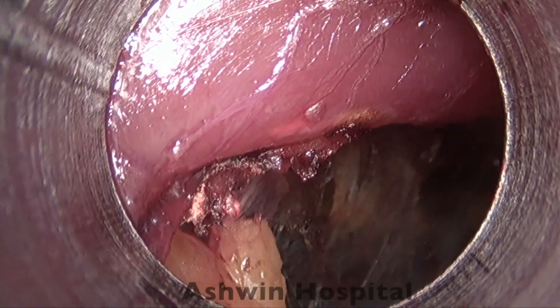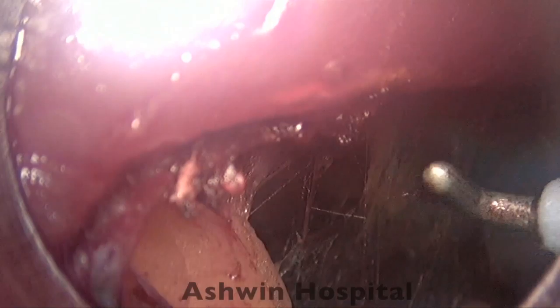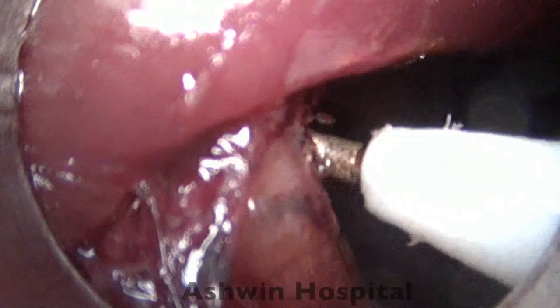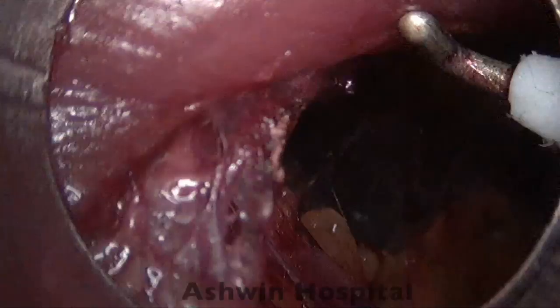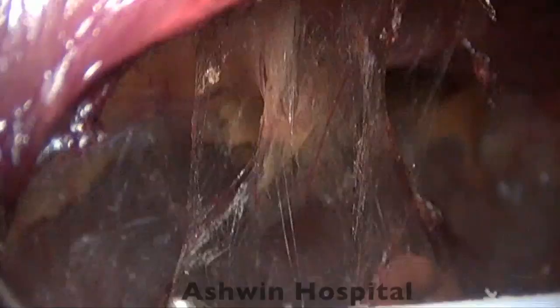So here you can see my telescope is actually inside the port. That is how close to the port near the umbilicus we are working. So here we don't have much space, and this is the only difficult area where we have to manage and work so that we won't have too many problems or difficulty. So here, once again, you can see we're using the cautery in a cutting mode so that the dissection would be precise and not too much smoke would be generated.